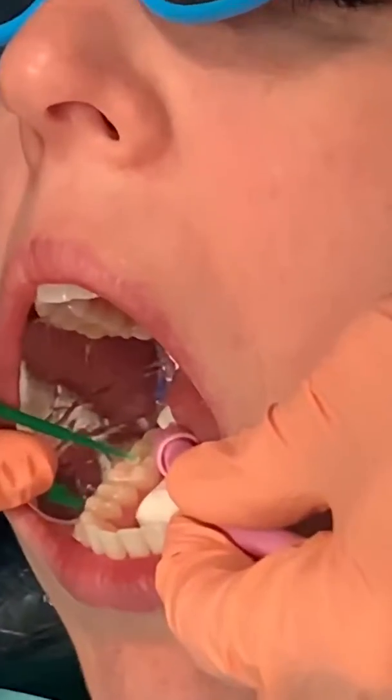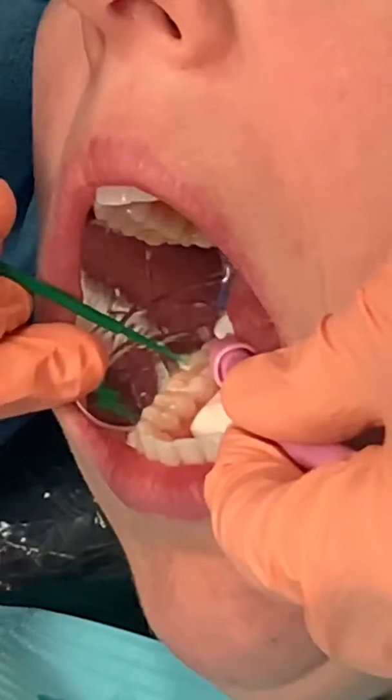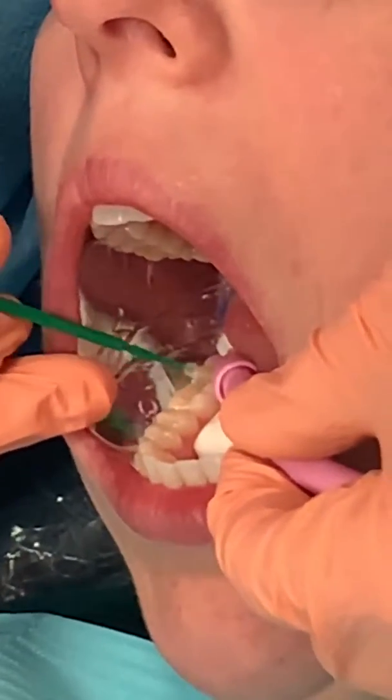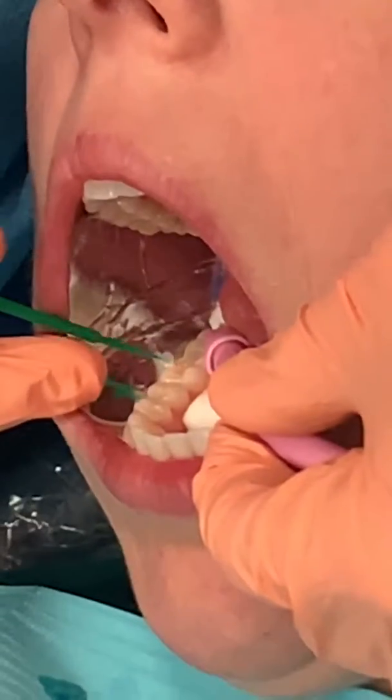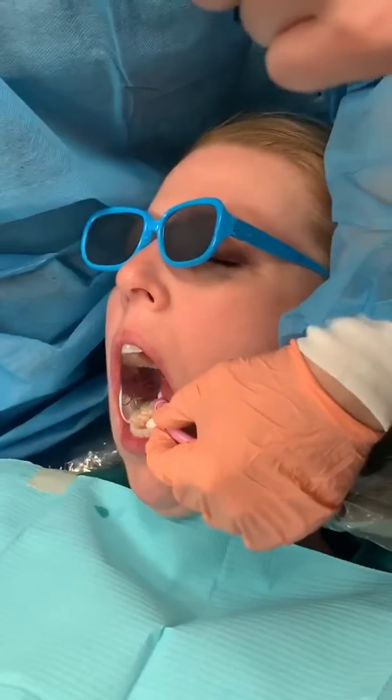If you're using a micro brush, be really, really light with it, because it sucks the sealant up real quickly. I feel like that's good — it's just in the pits and fissures.